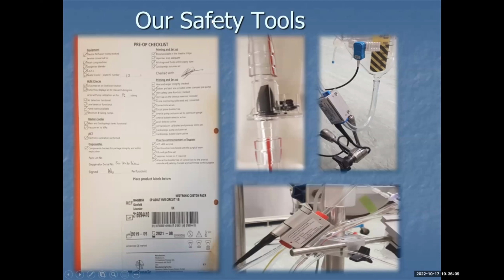These one-way valves will be checked. And we do what we call a suction test, which you'll see down here, where we dip it in some fluid to check it is going in the right way, because unfortunately, this has caused many fatalities historically. The other things we have on the pump are what we call a level alarm.